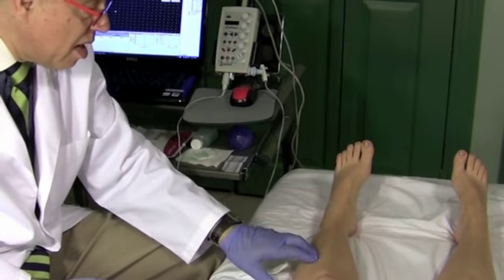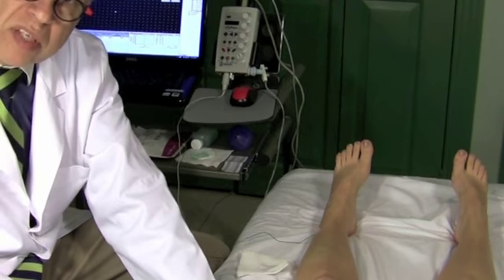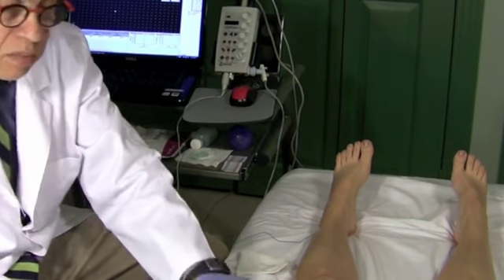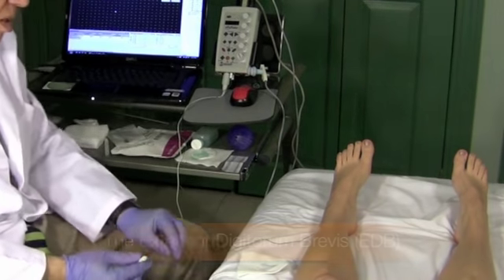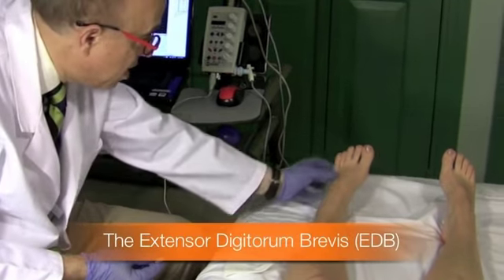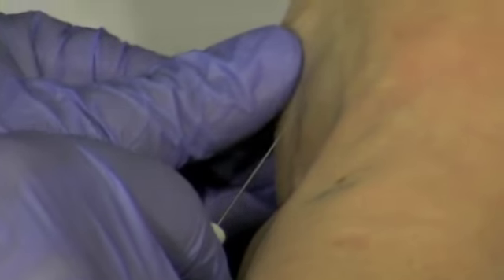Now, because these are L4, L5, and S1, we need to do a thigh muscle, which is an L3 muscle, and we do the lumbosacral paraspinal. So let's start with the extensor digitorum brevis muscle. And again here, what you do is you point your toes up and relax. Now I see the muscle, and we're going to put the needle inside of this.